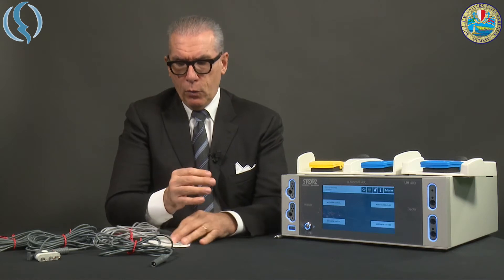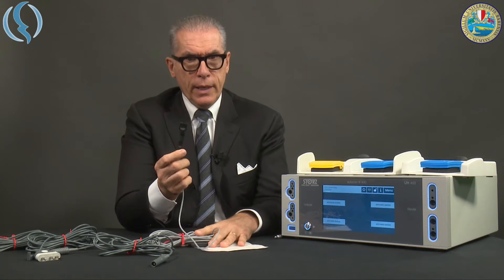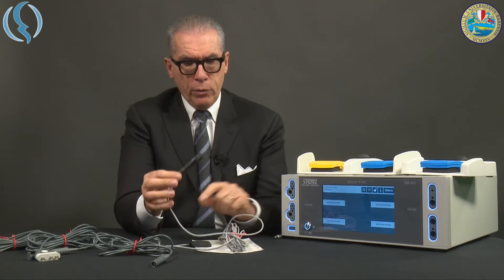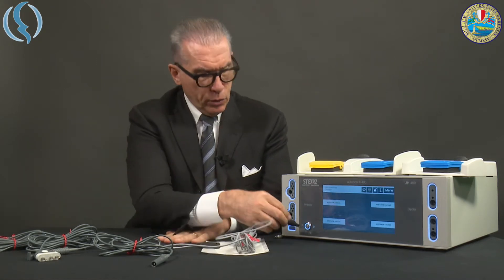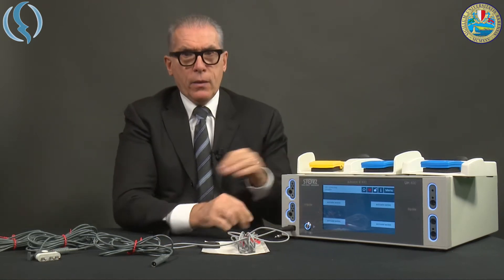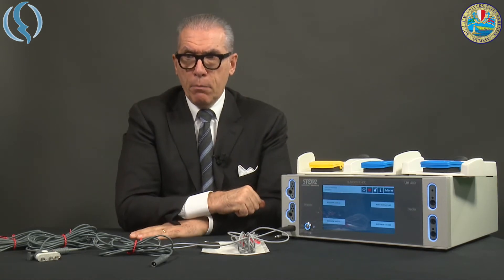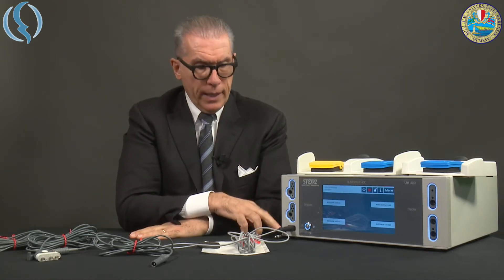We are now ready for the connection of the electrical cables. First of all, we have to connect, for the use of the monopolar energy, the so-called neutral plate — that is the return electrode — that goes into this dedicated plug. You see that the symbol of the neutral plate gets red.